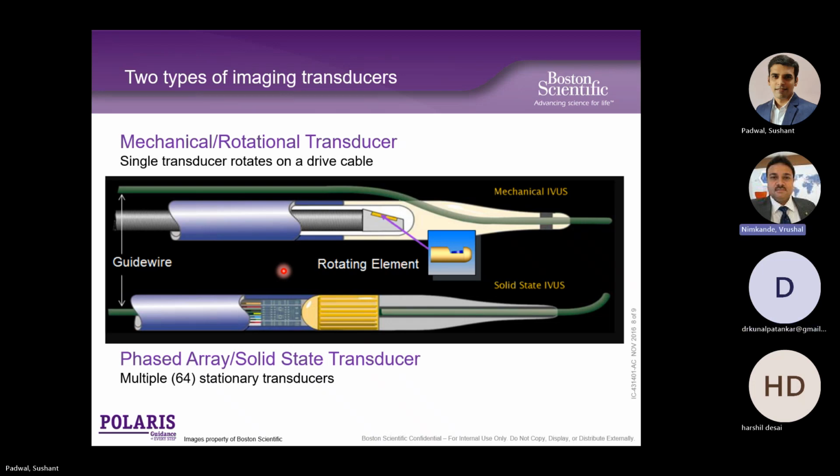So one more thing here. In a solid state catheter, can you see the cables, the positive, negative, and the neutral cables? These cables run parallel. So this catheter is more of an imbalanced catheter. These are the cables which are running across, and since it's an over the wire catheter, it is very difficult or bulky also to deliver. And there is a 6 degree blind spot in each of the solid state transducers which are attached.